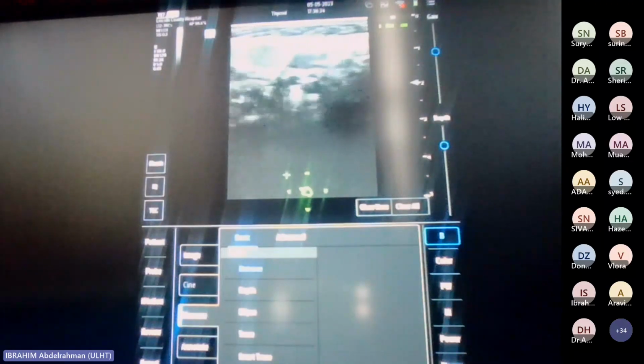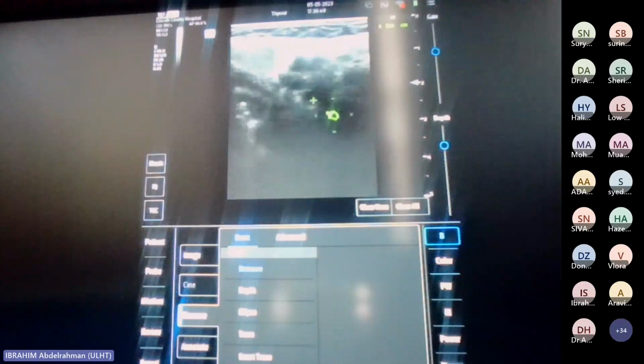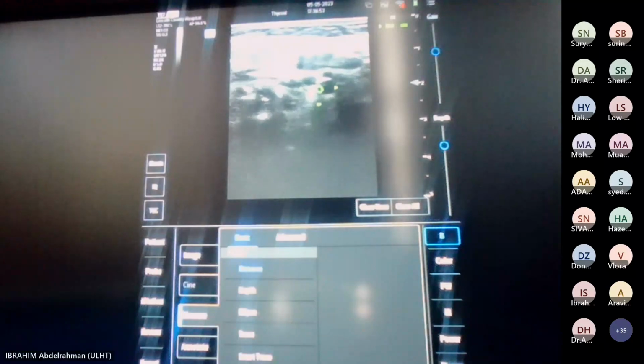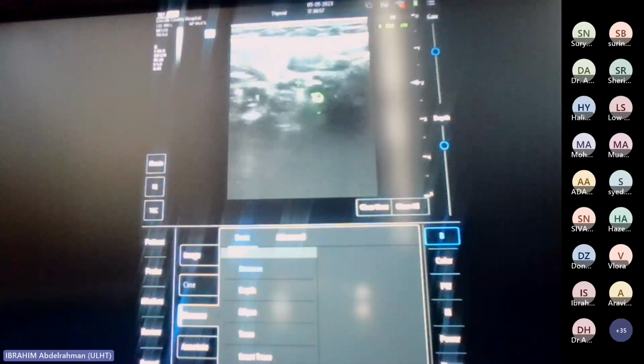And I think just seeing as this is a head and neck workshop, coming back to level 2 is important because of the pathology that we can see in that area, as well as lymph nodes. Because the carotid bifurcation sits here, we need to remember that there could be a carotid body tumour as well. And then also schwannomas from the vagus nerve.